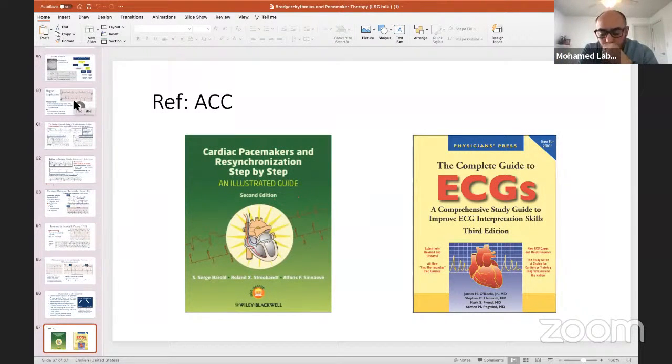I usually have almost a template. Use bipolar cautery if possible, though usually it's unipolar cautery that they use. Short bursts, as Dr. Mohamed said, and you basically put a magnet or asynchronous mode. If it's an ICD, that's not going to work.